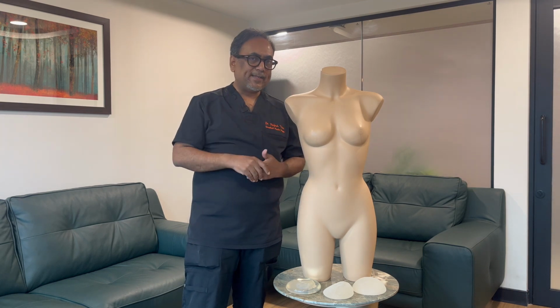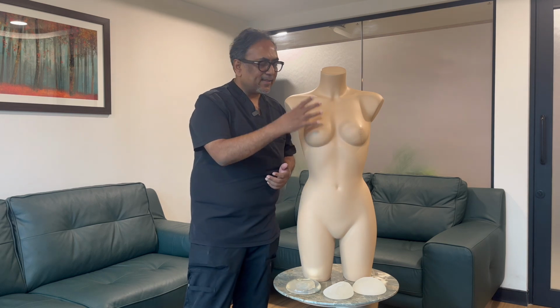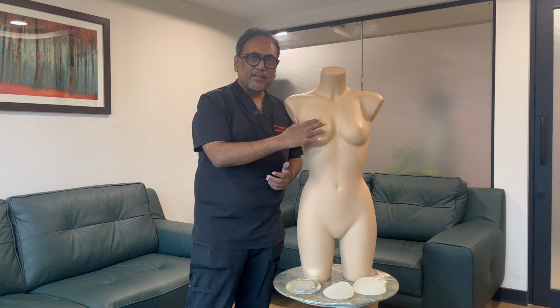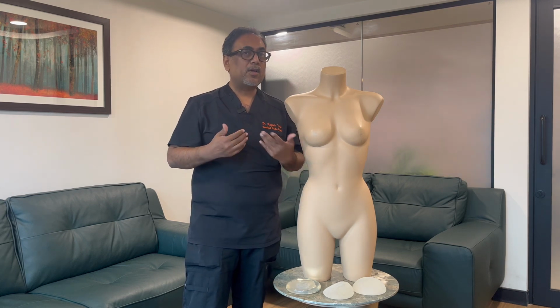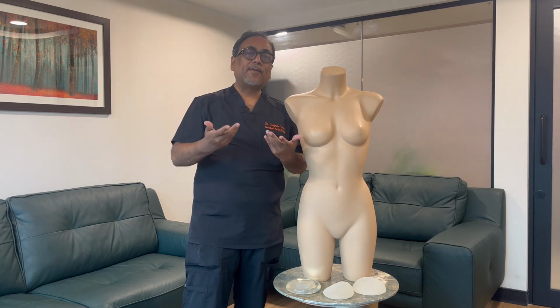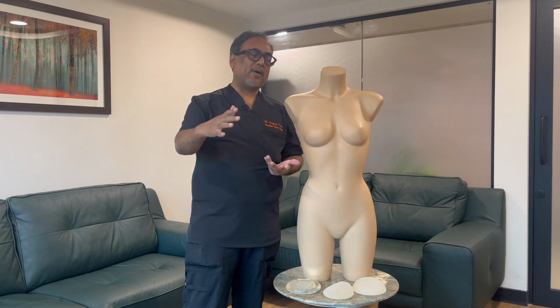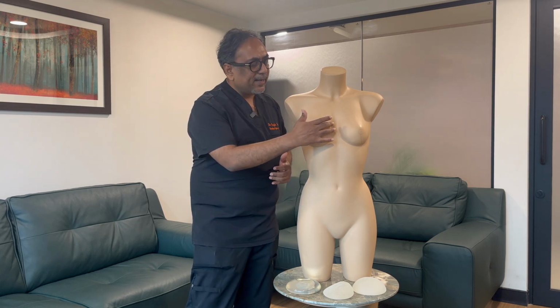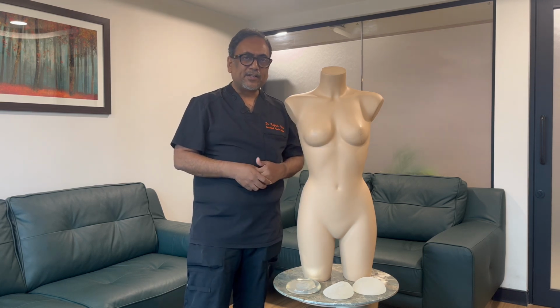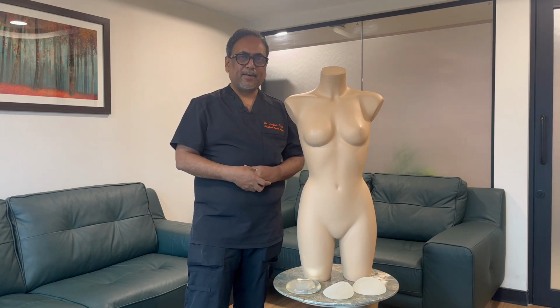Now, there are two possibilities. The patient either likes it or doesn't like it. If the patient likes it, that's the volume of the implant which is going into the patient. If the patient doesn't like it, either it is too big or too small. So the patient may opt for an implant which is either smaller or bigger. So this is like understanding the patient's wishes, and then we keep the limits under consideration and go ahead with the perfect implant for the patient.